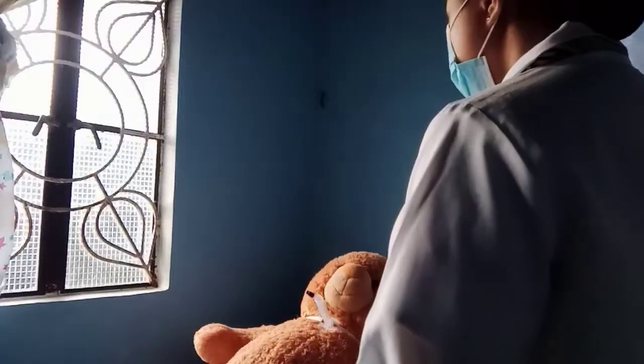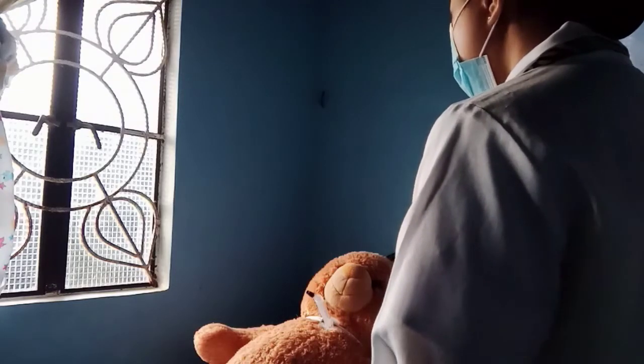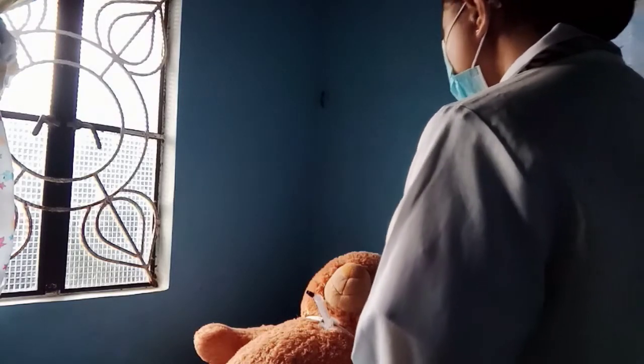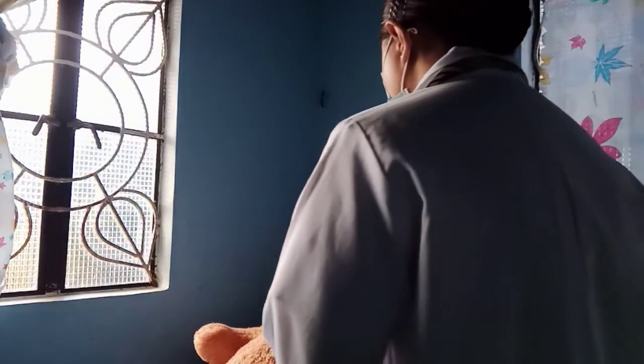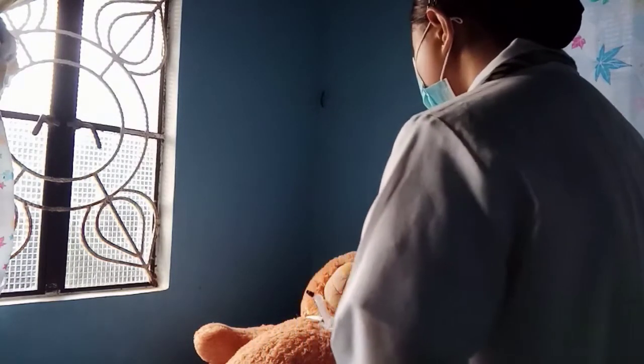Next, identify the patient. Good day sir, I'm your student nurse for today. Can I get your name? How old are you? Okay, thank you. Close the curtains around the bed and close the door to the room if possible.